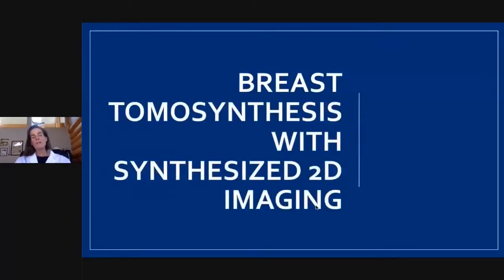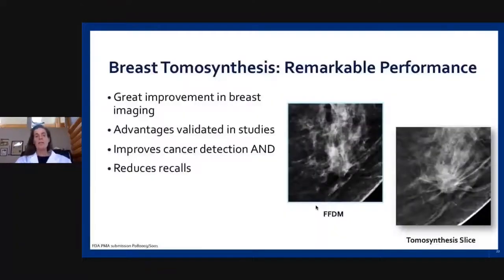So now we're going to transition a little bit and talk about tomosynthesis with the synthesized 2D imaging. And this for me was really exciting when we started talking about synthetic views. And so we all know that breast tomosynthesis obviously performs very well. It was a great advancement, and I've been around for a while, and I read film screen, and I went through the digital transition, and then I went through the tomosynthesis transition.